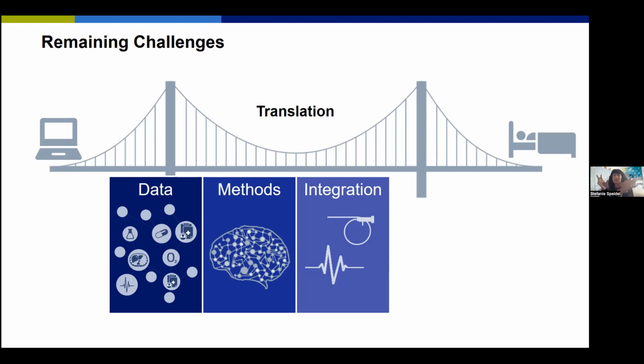And there we have the hardware versus the software, because the display technologies we have right now, when it comes to augmented reality, for example, the HoloLens and so on, as I said, has not the level of maturity we need for surgery. And then you also have to provide intuitive human-machine interaction. So, for example, an activation on demand would be nice, or a context-aware system.